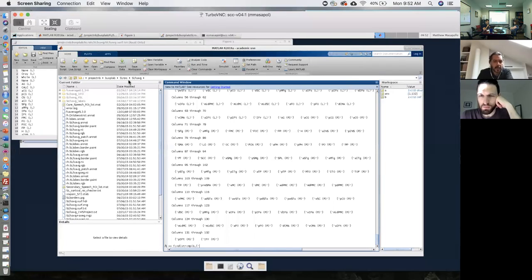Let's see what we wanted: ventral motor cortex, ventral premotor cortex. Then which other ones do we want? Mid ventral cortex and mid premotor cortex, something like that. Yeah. Well, let's try with these ones, and then we'll see where we come.